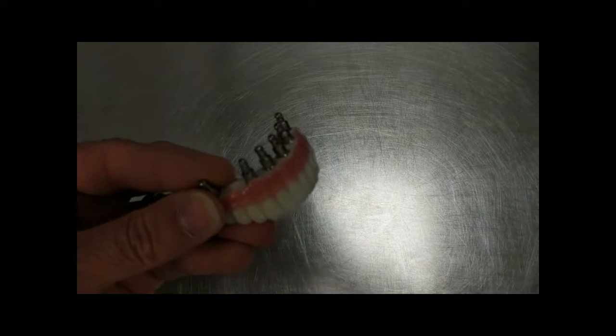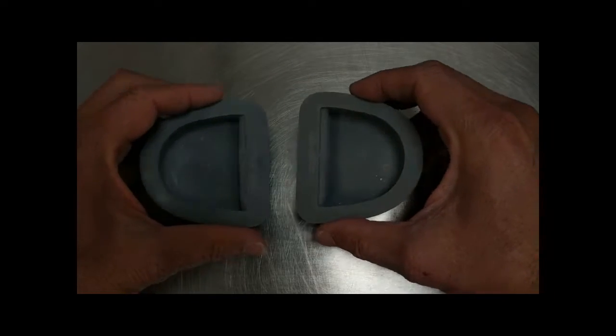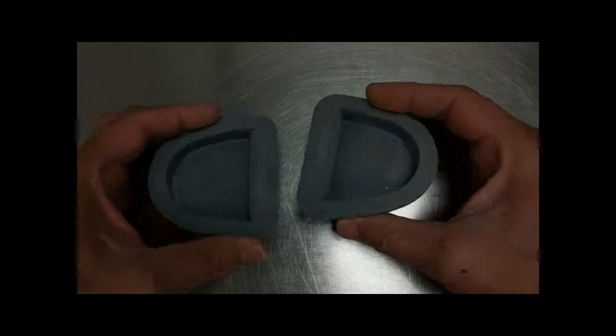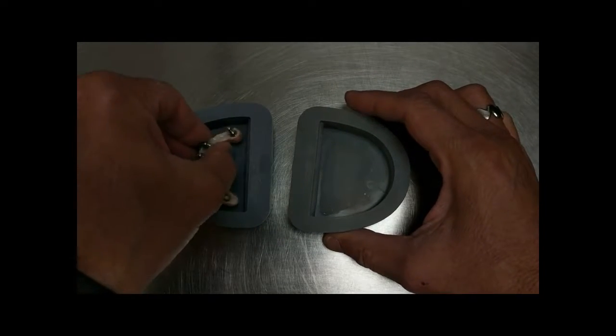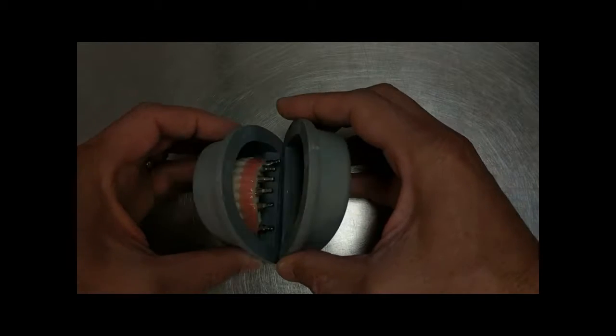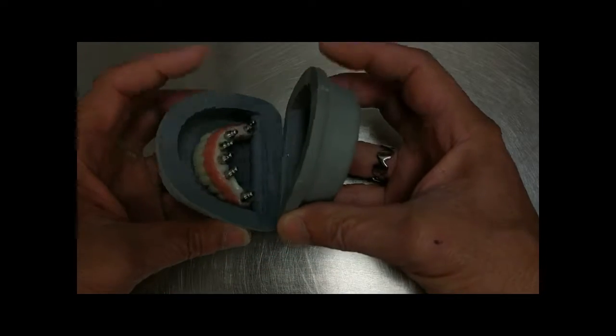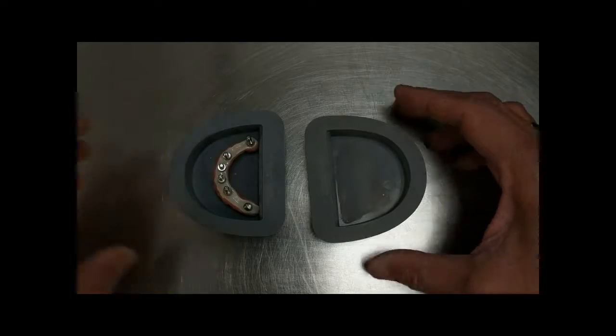The next step is to flask. This can be accomplished with either a laboratory flask or even a denture cup or a retainer cup. The important thing is that the height of the overall prosthetic with the analogs fits inside the flasking device.